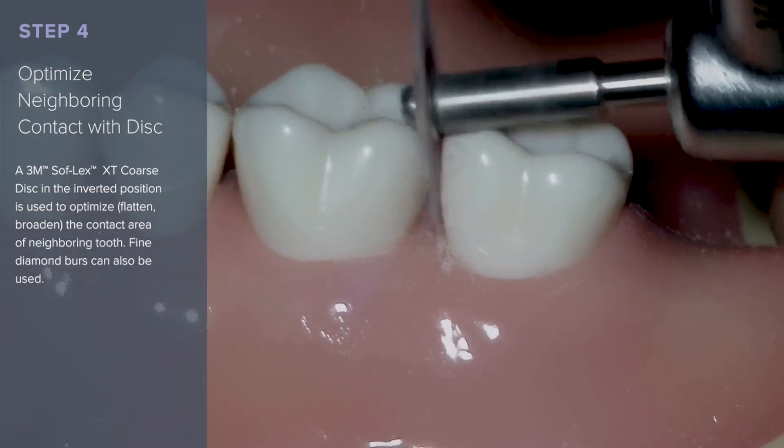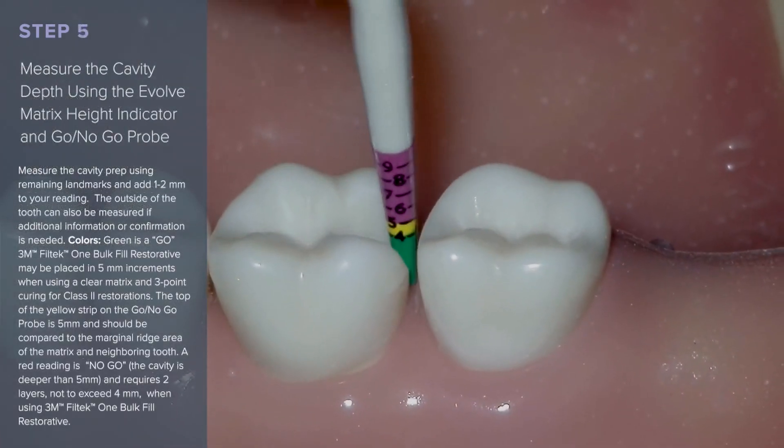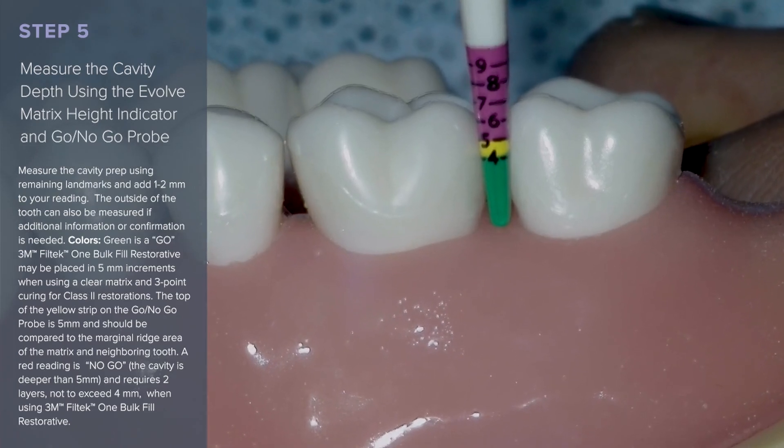We like to use the 3M Softlex XT coarse disc in the inverted position. Measure the cavity depth using the Evolve Matrix Height Indicator and Go No-Go Probe. Measure inside of the cavity prep and then outside of the cavity preparation to assess where the gingival attachment is.